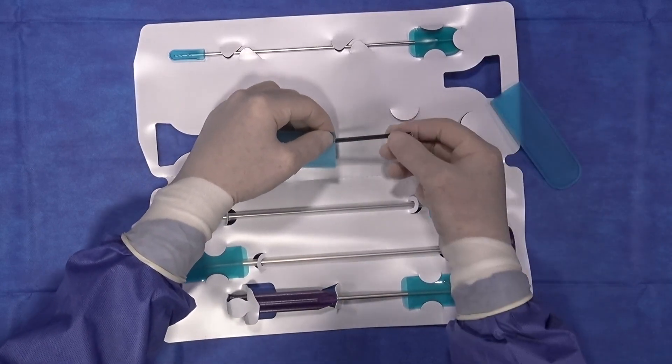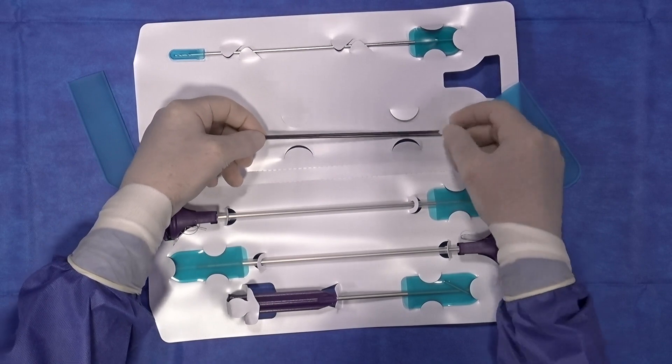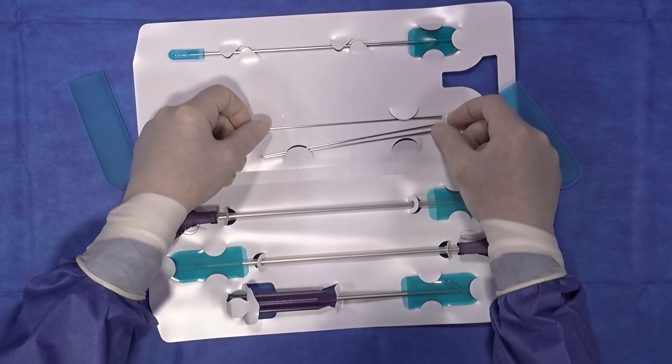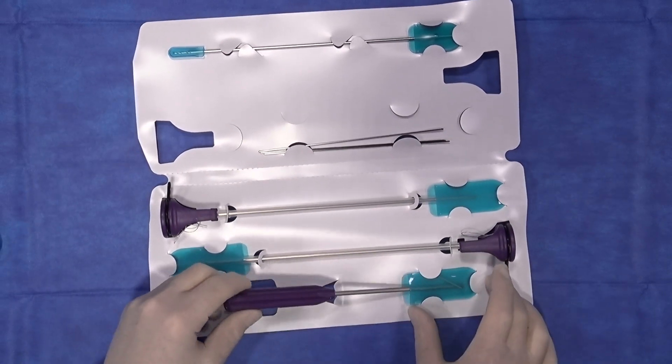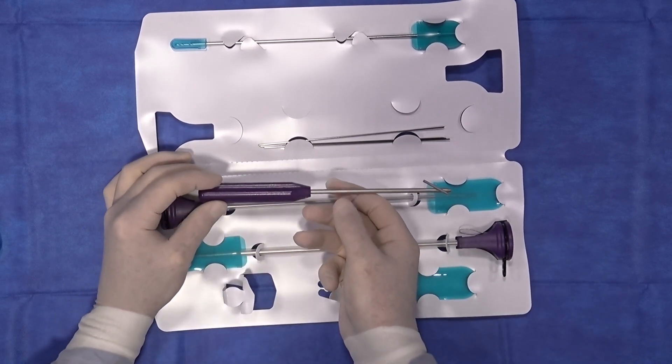First are the guide pins — the kit comes with three guide pins. The second important piece of equipment is the guided arthroscopic placement guide, or the GAP guide.